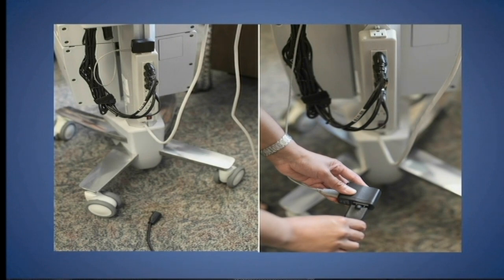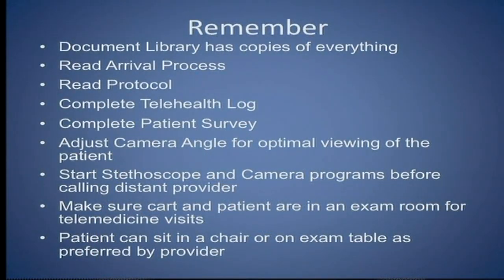Now that you know how to use the telehealth cart, some things to remember. The document library has copies of all forms under the section Telehealth. Please use it. Make sure to read the arrival process for the distant provider you are working with, and read the designated protocol. Complete the telehealth log and the patient survey after every use of the telehealth cart. Adjust the camera angle for optimal viewing of the patient. Make sure they're in the center view.